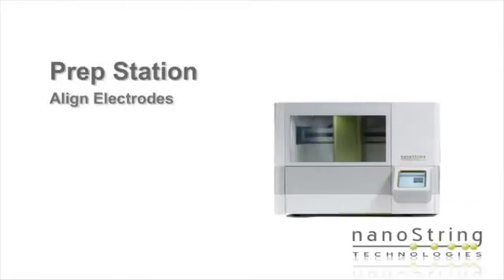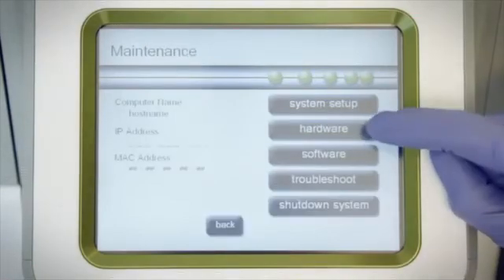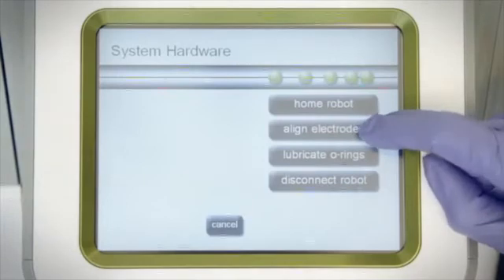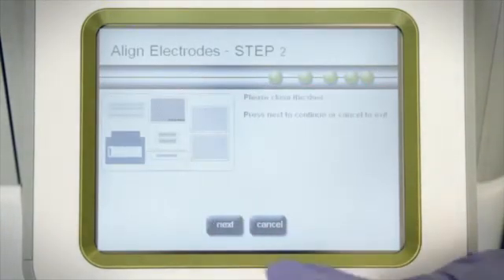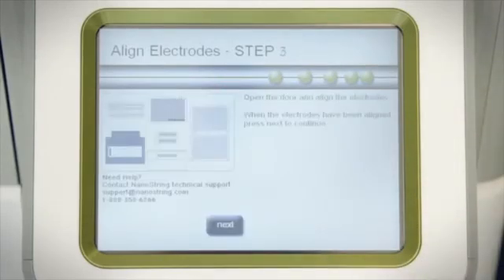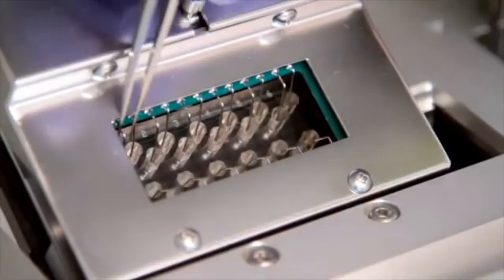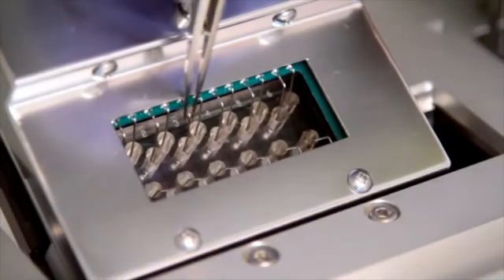Occasionally, the electrodes might become bent. Because they are wires, they can easily be bent back into the correct position so that they sit inside a well of a cartridge. If the electrodes become bent and need to be straightened out, go to Maintenance, Hardware, Align Electrodes, follow the instructions on the screen, using either forceps or fine needle nose pliers, bend the wires so that they're back into the well that is appropriate for them.